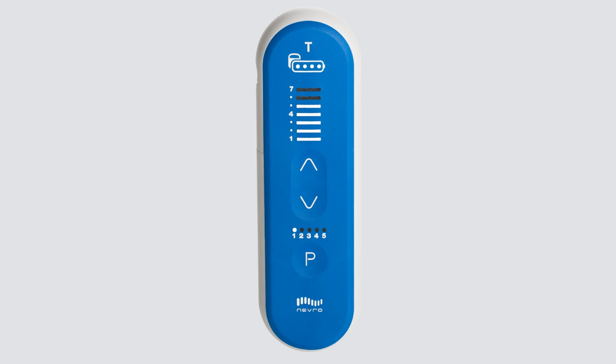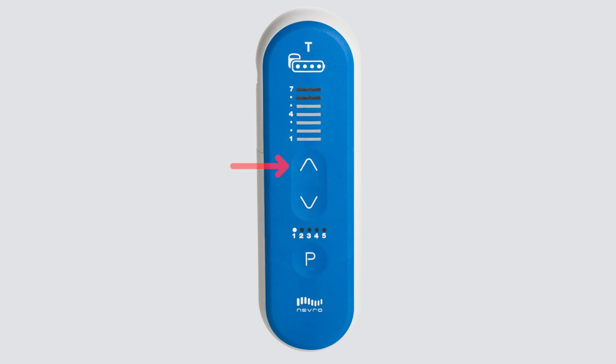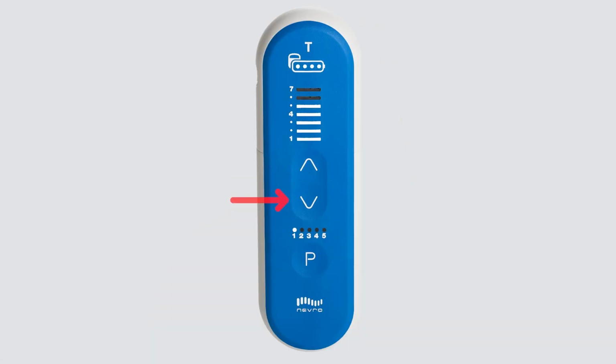Once connected, the lights on your remote will display the battery level of your trial device as well as your selected program. Illuminated lights above the up arrow indicate that stimulation is on. If stimulation is off, there will be no lights illuminated above the up arrow. To turn stimulation on, press the up arrow once and the numbered level lights will illuminate. To increase or decrease your stimulation level, press the up or down arrow until you see the desired number of lights illuminated. Each time you press an arrow, you will hear a beep and lights will reflect the new level.